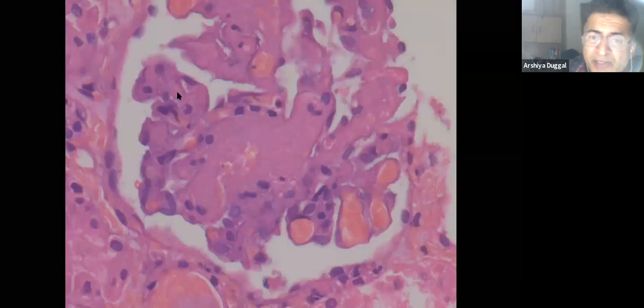I would say that in acute AMR, sometimes the AMR is so dominant that you see the majority of the glomeruli showing fibrin thrombi. So in this, you can see this is the glomerular capillary loop. These are the RBCs, so there are congested glomerular capillary loops. In addition, the remaining glomerular capillary loops are showing fibrin. So these are the glomerular changes of acute AMR, where you find TMA and glomerulitis.